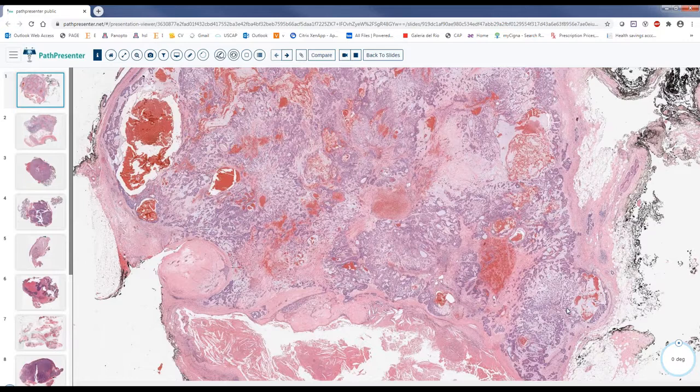However, when you see a very invasive, irregular tumor, don't jump to the conclusion that it is benign. Try your best to really see what's going on, and this could be malignant. So well circumscription we see in benign and malignant, but with very infiltrative lesions, we are more suspicious of malignancy.